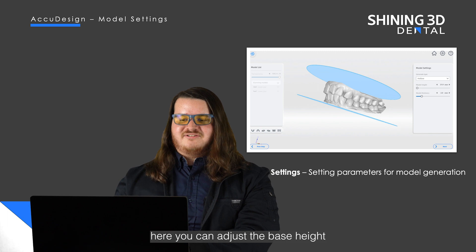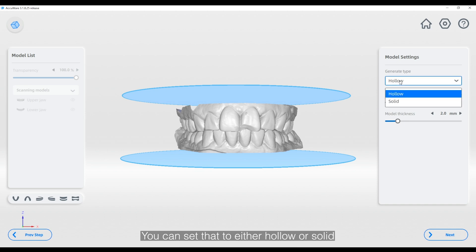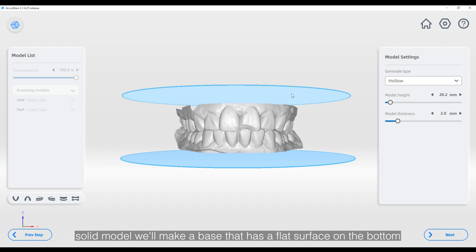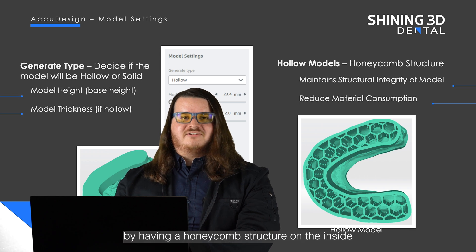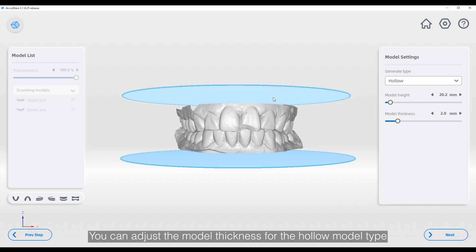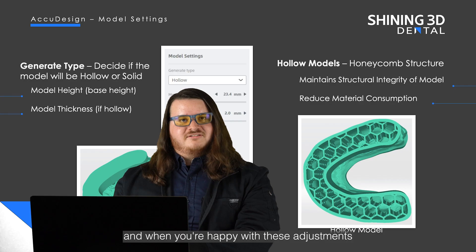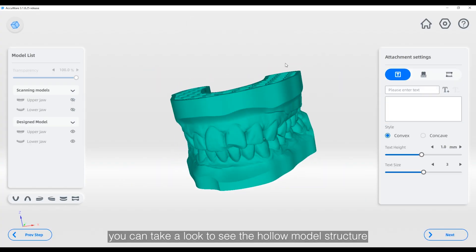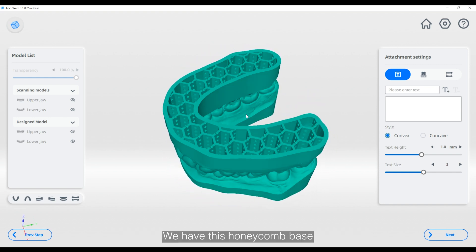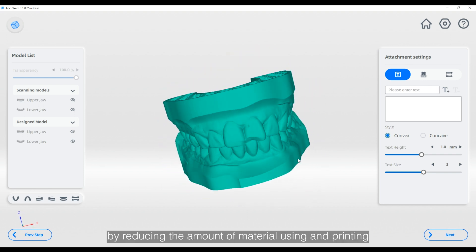Next we have the model settings page. Here you can adjust the base height and the generation type, which you can set to either hollow or solid. The solid model will make a base that has a flat surface on the bottom, while the hollow model will save on resources by having a honeycomb structure on the inside with drain holes. You can adjust the model thickness for the hollow model type. Once the model is finished generating you can see the honeycomb base, which maintains structural integrity while reducing the amount of material used in printing.